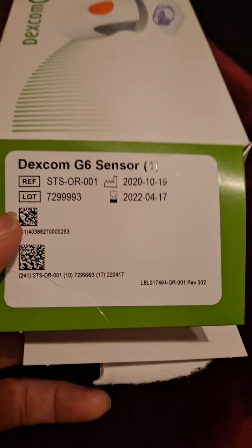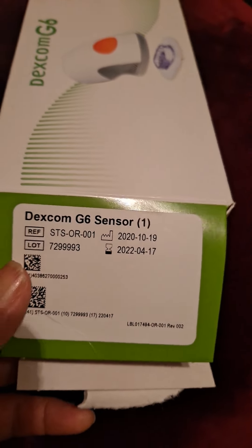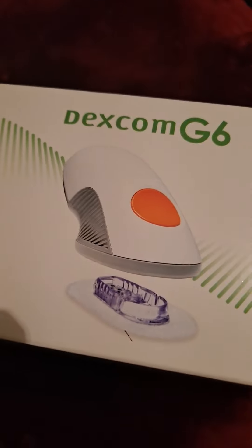This time I had to order a single sensor because Jerry finished his sensor refills before it was time for another refill. I went online and bought a single sensor for $120. This is the box it comes in — this is the Dexcom G6 sensor.